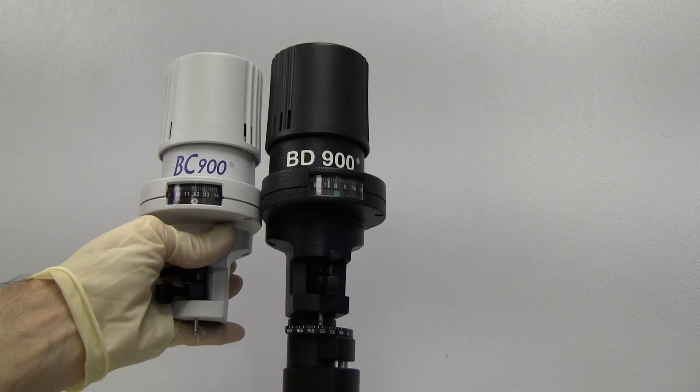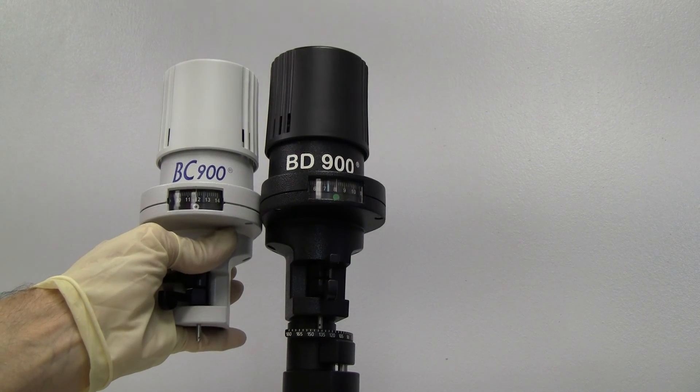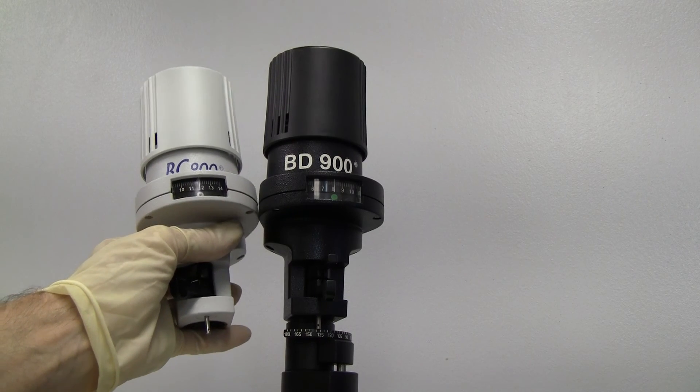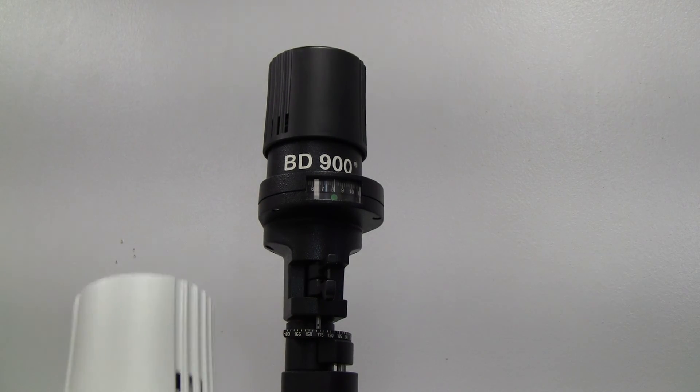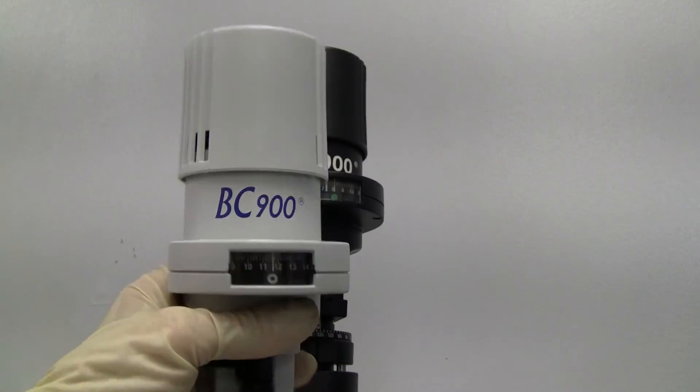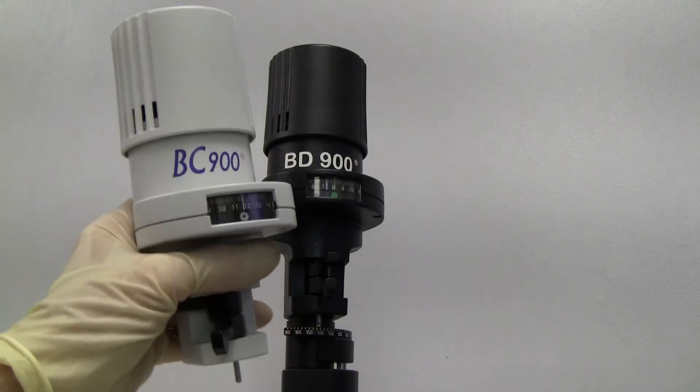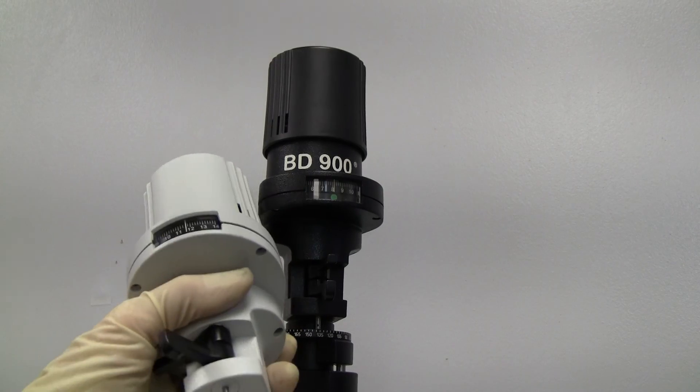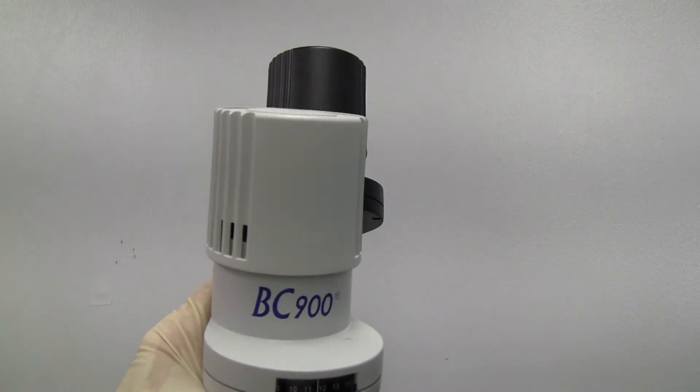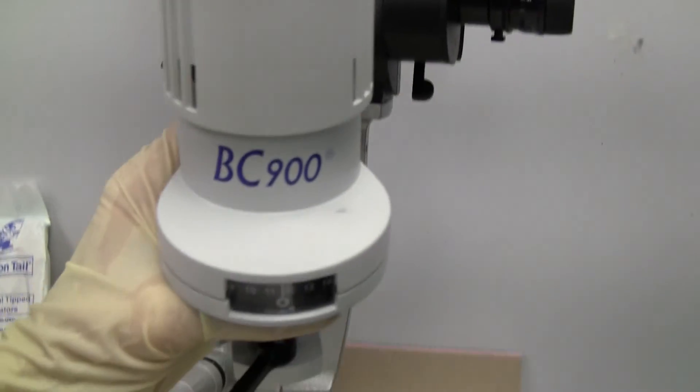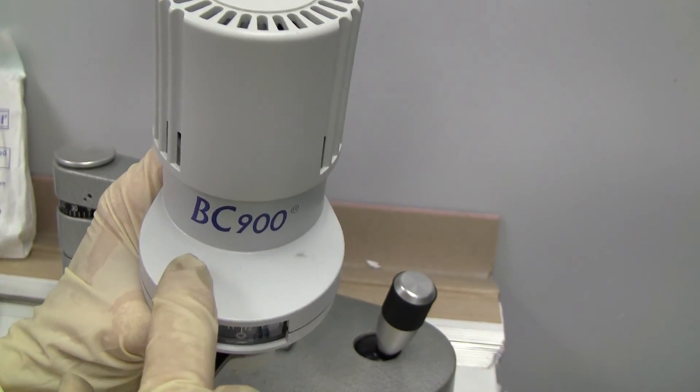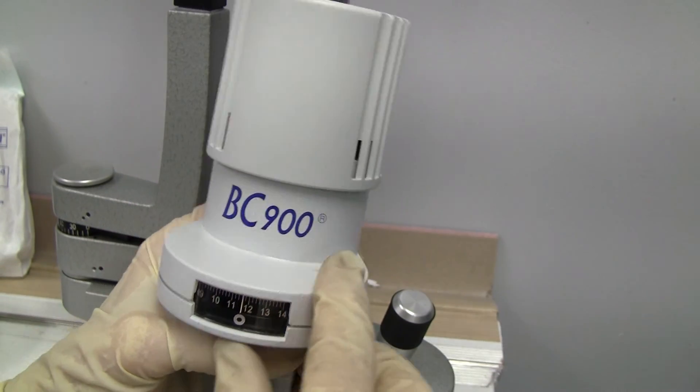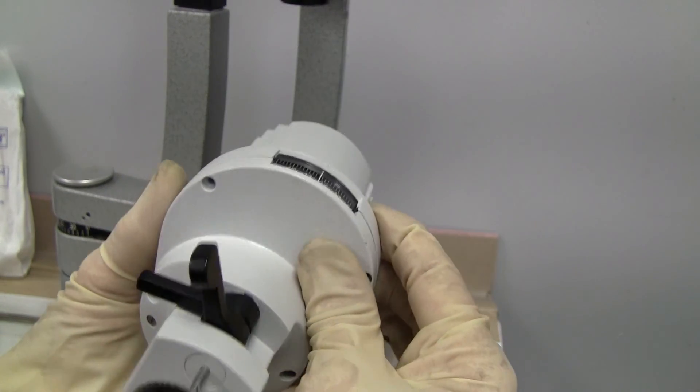On the Haag-Streit BC or BD900, which are pretty similar, we have the upper illumination top hat and it's a little different than the regular BM in that the screws are not on top. Instead, they are on the bottom.